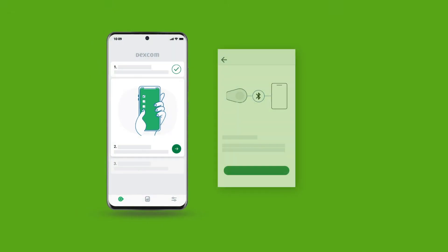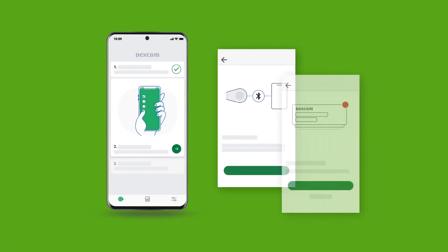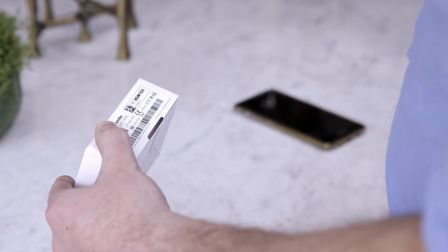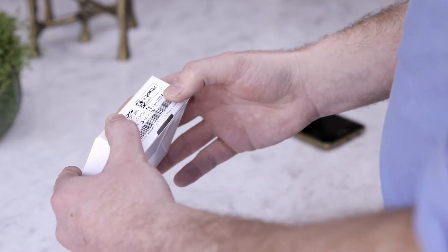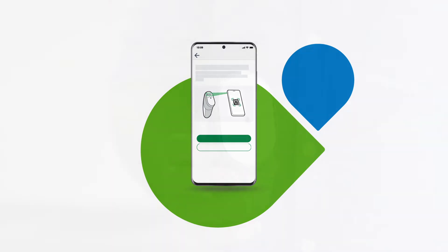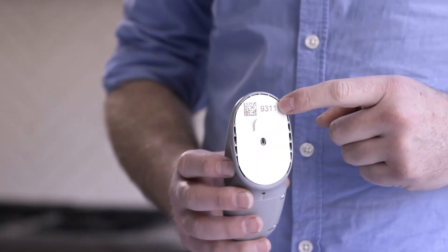The app will then walk you through connecting your phone. You will need to enable Bluetooth and allow notifications. Enter your transmitter serial number — the serial number can be found on the bottom of your transmitter box. Enter your sensor code, which is on the sensor applicator.